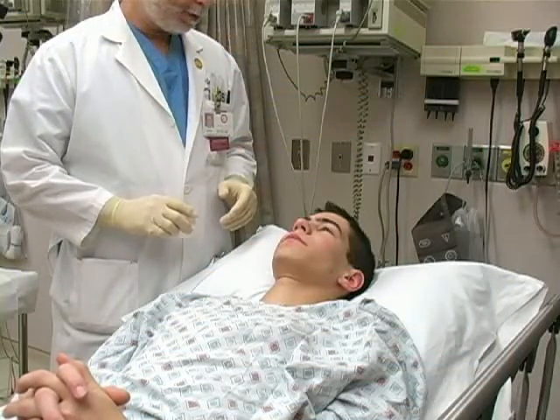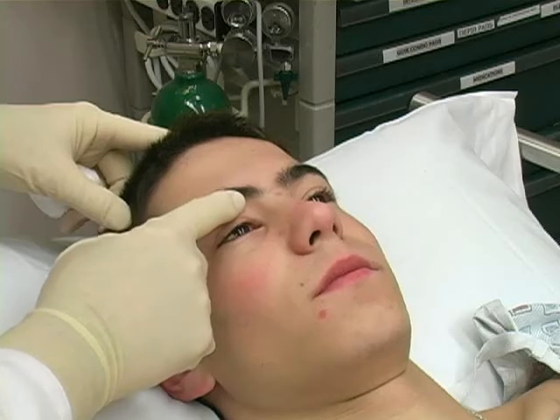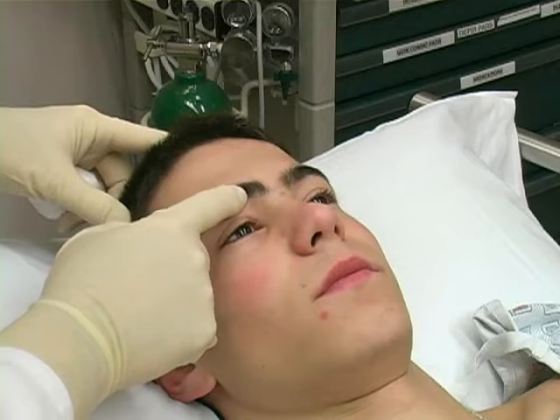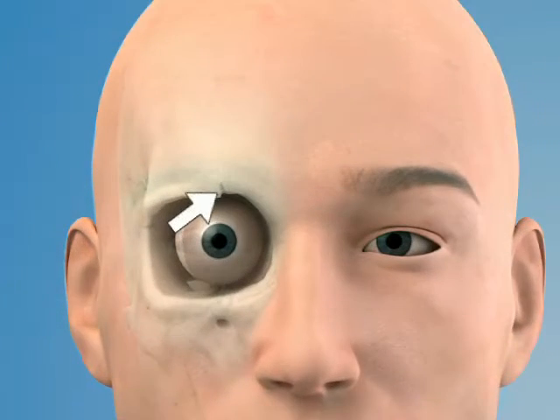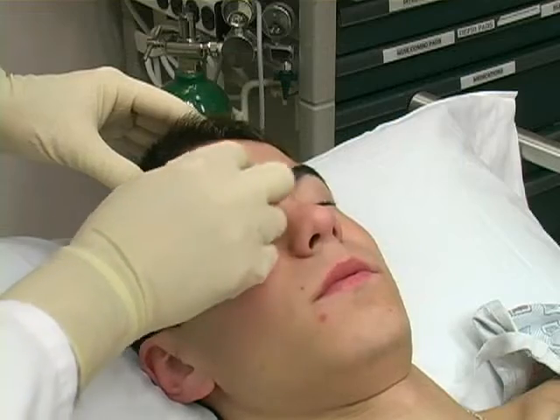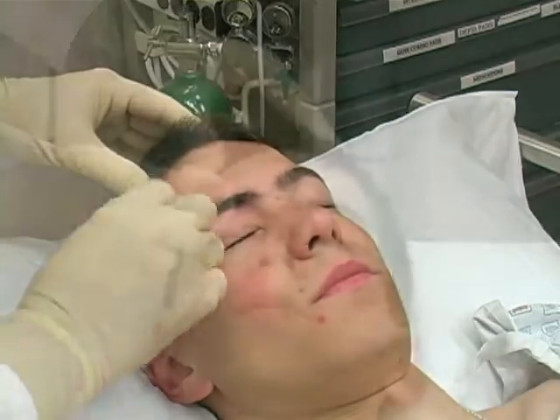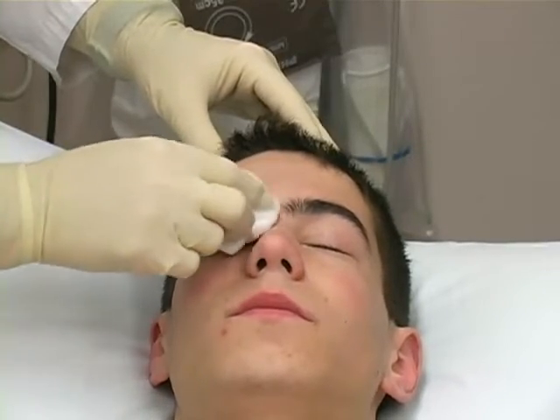To perform the block, position the patient supine on a stretcher. Palpate the superior orbital rim and identify the subtle supraorbital notch. This notch is in direct line with the pupil when the patient is staring straight ahead. Prepare the skin around the notch with a cleansing agent such as chlorhexidine. Use care not to introduce the agent into the eye.